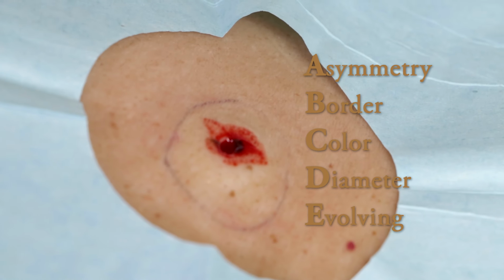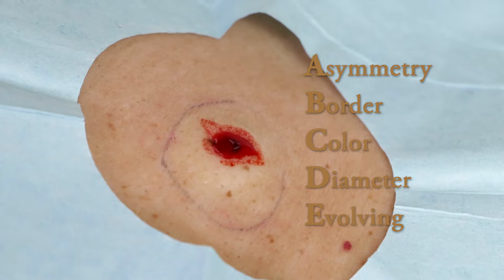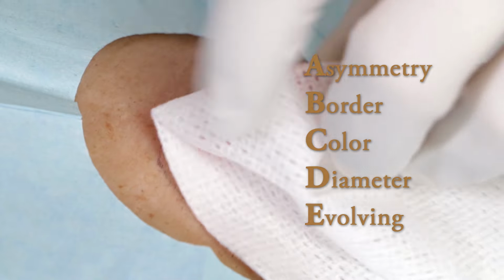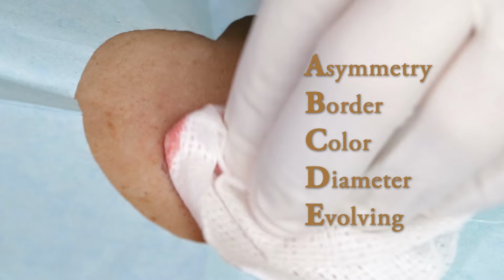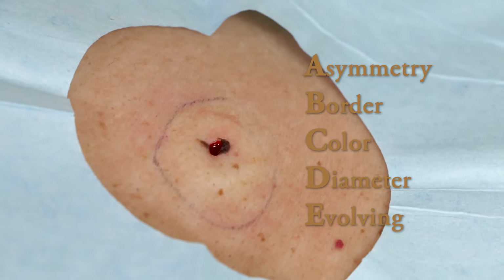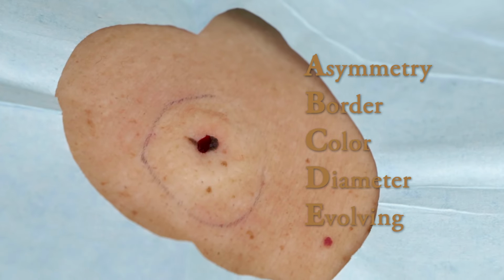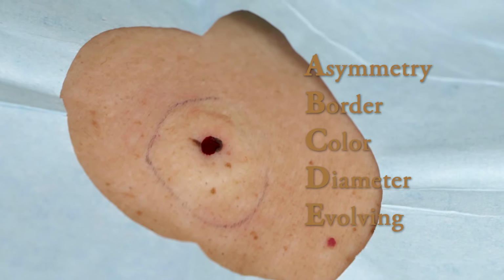I'm going to put that in the little sample container here. C is color not uniform, so there's variation in the color from one part to another. This one doesn't really have that so much. D is for diameter. A diameter greater than 6 millimeters is concerning, or the size of a pencil eraser, and this one is larger than that. It's about 12 millimeters from here to here. And E, evolving size, shape, or color. Anything that's changing, especially if it's changing rapidly, we get concerned. This one wasn't changing, but it does have 3 points for the asymmetry, the border irregularity, and the diameter greater than 6 millimeters.